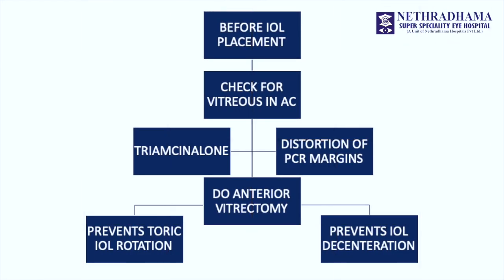If you are placing an IOL in the bag, see that you have cleared the bag and the AC completely of vitreous, otherwise the lens will not centre well and the axis of the lens may shift — especially with a toric IOL. You can look at the margins of the PCR, which gives you an indirect clue as to whether there is vitreous prolapse. If visualisation is poor, you can use triamcinolone to stain the vitreous, see the strands, do a thorough vitrectomy, and ensure there is no vitreous in the capsular bag before implanting the lens. Once the lens is implanted, again look at the margins of the PCR and see that they are not distorted — this gives you a clue that there is no vitreous in the capsular bag. If vitreous comes into the capsular bag, it can decenter the lens or misalign the toric IOL.